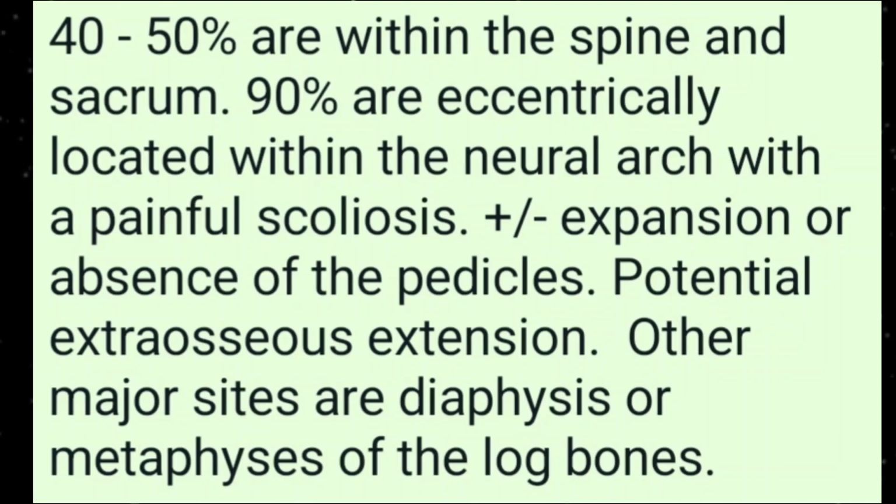So far as its location is concerned, 40 to 50% are within the spine, especially the sacral area. 90% are eccentrically located within the neural arch with a painful scoliosis. There may or may not be expansion, or there may sometimes be absence of the pedicles. Potential extra osseous extension is a characteristic of osteoblastoma, and other major sites are the diaphysis or metaphysis of long bones.